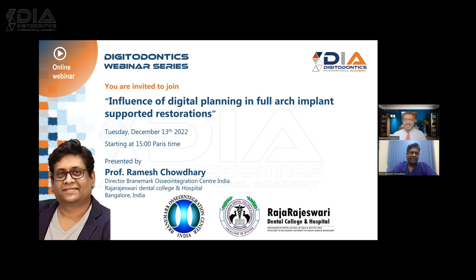I think we are still very new to Navident, so it's still an excitement. With guided surgeries, most of the time we have to believe in the guide. This is my experience. Whatever you've planned, you cannot change it. The guide is done. In a Navident procedure, if you feel there is a slight change you want to make in the plan, you can immediately change and accommodate that in the Navident system. But with a guide, it has been made and you cannot change anything. So you need to go with it.